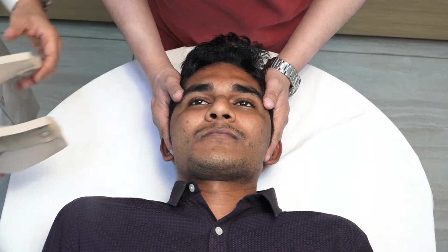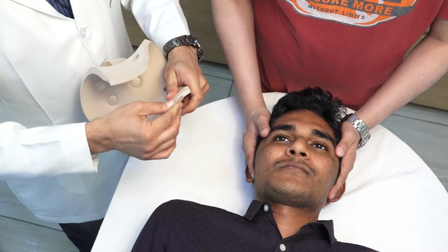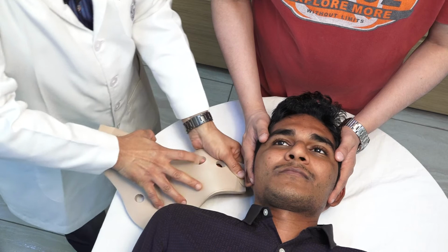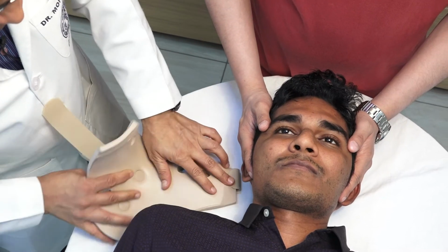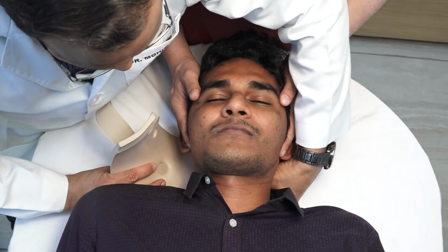Now what we do here is, once the patient is on the couch, Dr. Ankit, can you please hold and maintain the inline spine immobilization here like this. We take the posterior component of it, and we fold the strap over this, and then we flatten it as much as possible and pass this. Now this part remains up, this part remains down. We fold it back and then we pass it beneath the neck of the patient like this.